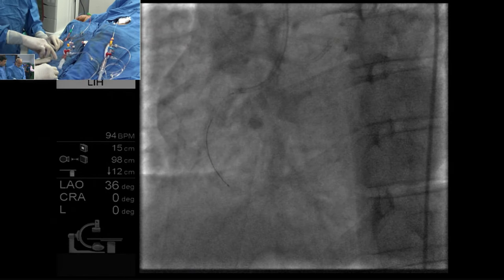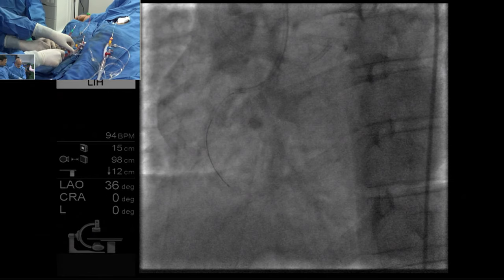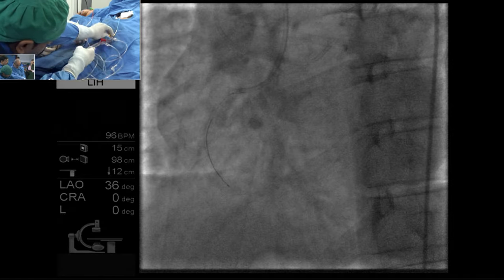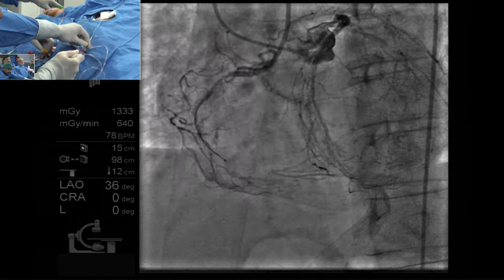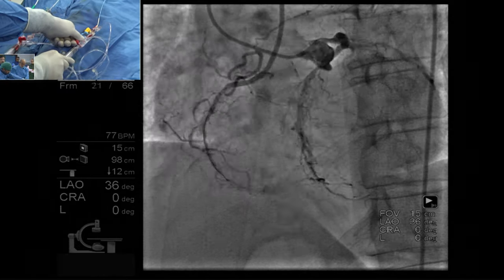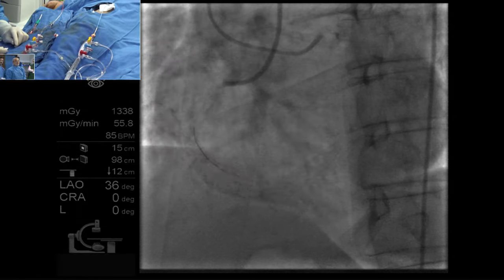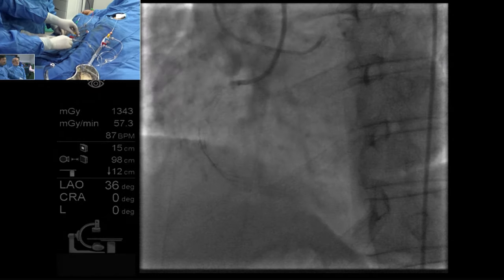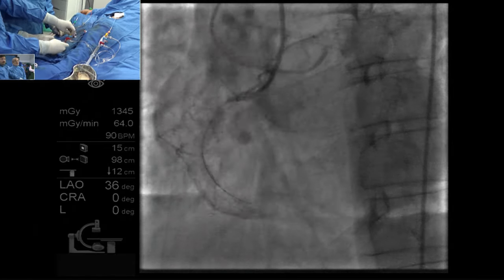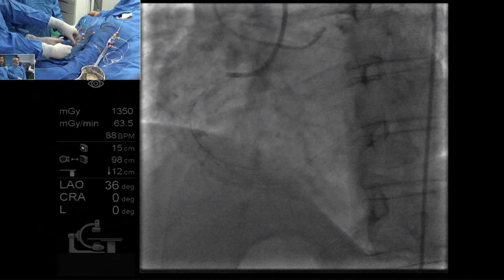Okay. Now I want an injection, Sanjay. Maybe a bilateral injection. Maybe I need to ask the panel a question. When you do a CTO, you set up your limits for radiation, contrast, and time. Any limit? Well, we start setting bells off when we go over 5 grays. Our limit is six. Our reportable is 6 gray, so we have an alarm that goes off at 3.